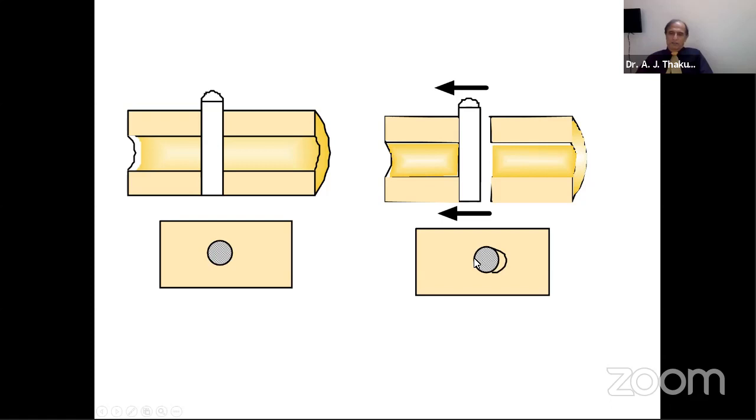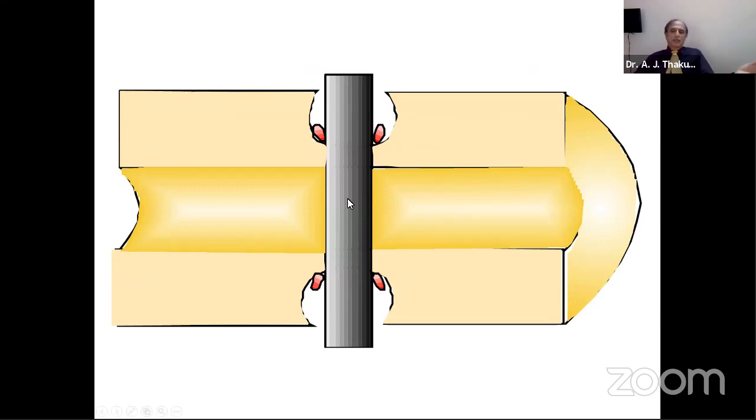So gradually, with repeated deformation, the hole will become big. The screw will lose its grip on the bone matrix. Eventually, it will start wobbling and will come out. Not a happy situation if you want to use that external fixator for a length of time. Once the movement occurs, the osteoclasts start working, both at the periphery and at the endosteal level, at both edges. Because of the moving, the osteoclasts will destroy the bone and eventually the pin will become loose. It will wobble. Then because of the movement, it will get infected. And there will be a debacle.